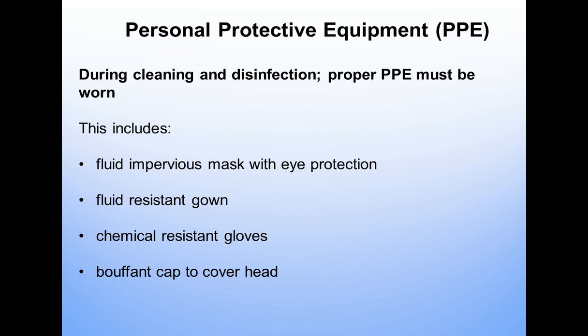Personal protective equipment, PPE. You have to protect yourself, of course, and your client, but certainly yourself. During cleaning and disinfection processes, proper PPE must be worn. And this will depend on what procedure you are performing, but fluid impervious masks with eye protection, a fluid resistant gown, chemical resistant gloves, and a cap to cover your head.